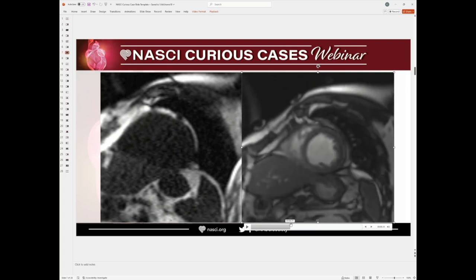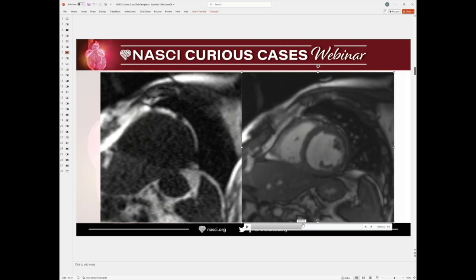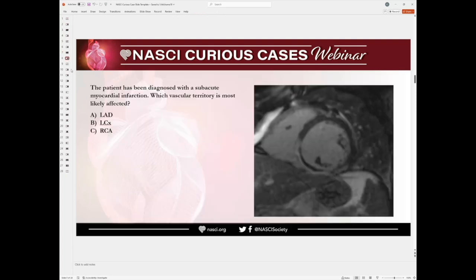What happens is when the patient has had an MI, acute or subacute, or even chronic phase, when there's fibrosis, you may start seeing re-entry that will cause arrhythmia in those patients. All right, let's move on to the next one.